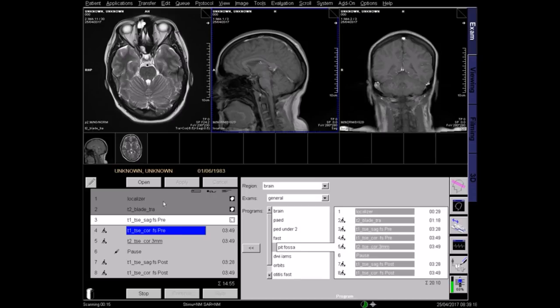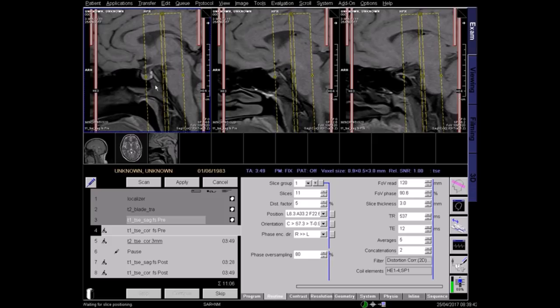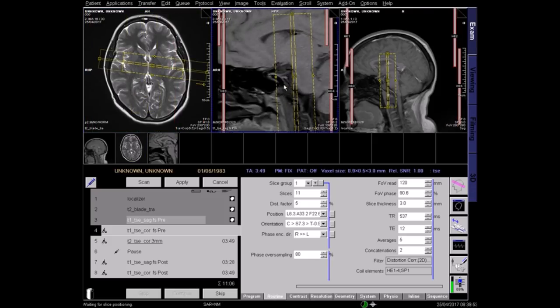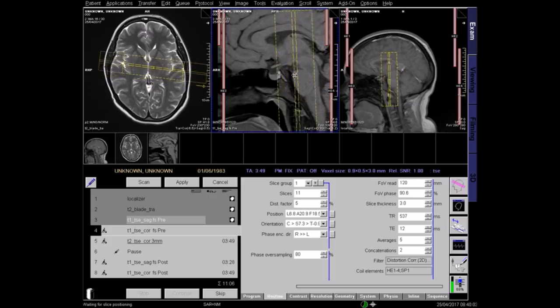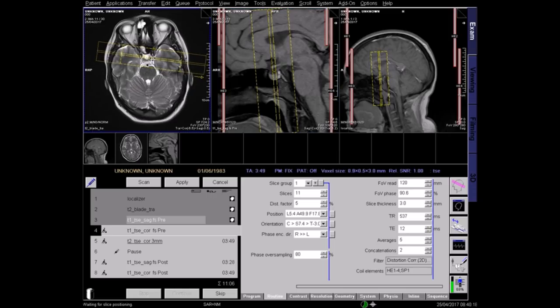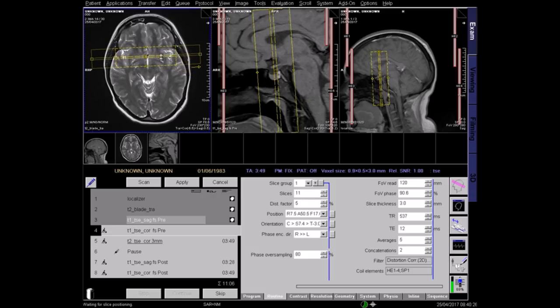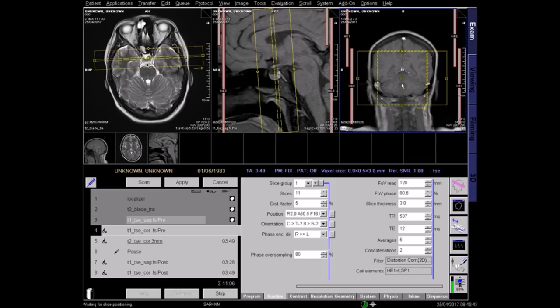Plan the T1 coronal fat-saturated sequence on the acquired sagittal sequence. Angle perpendicular to the sella turcica, ensuring the whole gland is covered. Centre on the gland in the axial view, aligning the slices perpendicular to the midline of the brain.